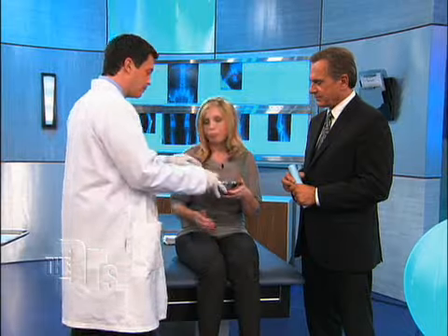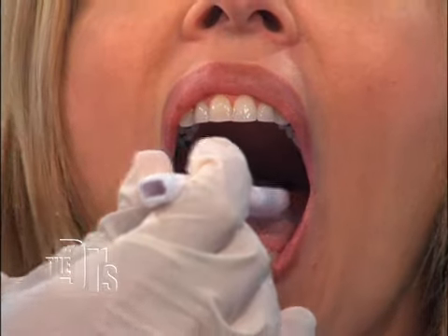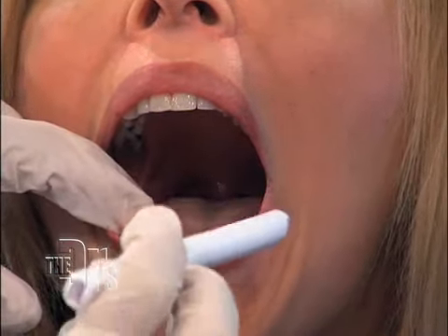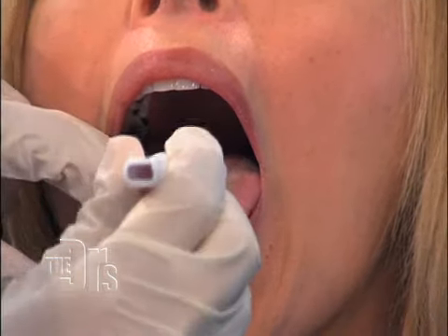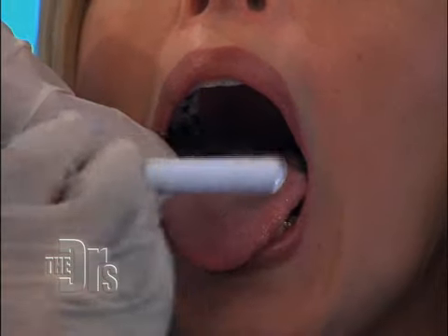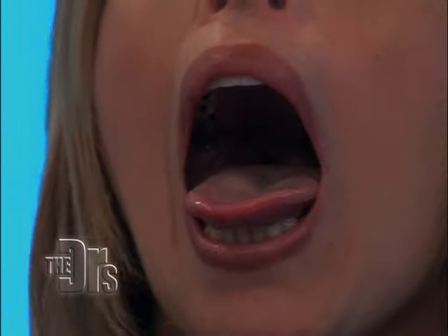Teresa, go ahead, you can spit it out. All right, let's take a look. Say ah. Okay, and stick your tongue out for me. That's great. Perfect. So fortunately, Teresa is a healthy young lady. No lesions, as we would expect. And as I'm sure she's happy about.